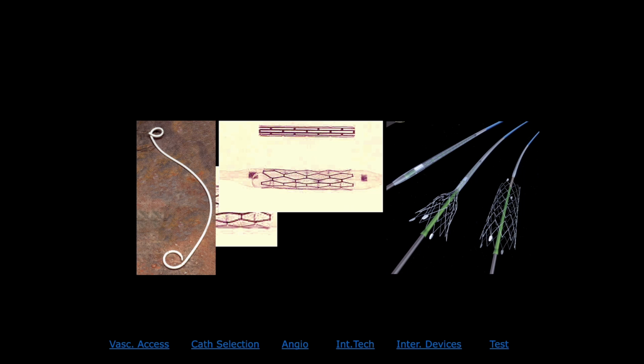And then this is mounted on the top of a balloon catheter. Balloon catheter means simple angioplasty balloon catheter. So when the angioplasty balloon catheter expands, these offset slots will become diamond shaped, expand and diamond shaped. So it will expand. When the balloon is deflated, this metallic stent will hug onto the arterial wall and the balloon can be taken out. So it will prevent the blood vessels from collapse.